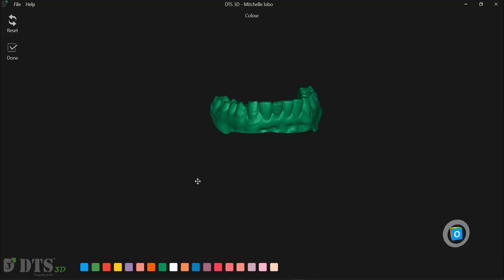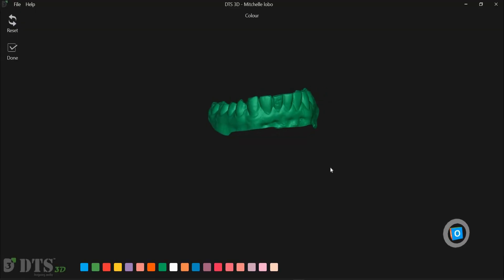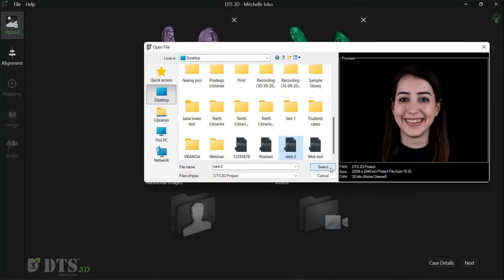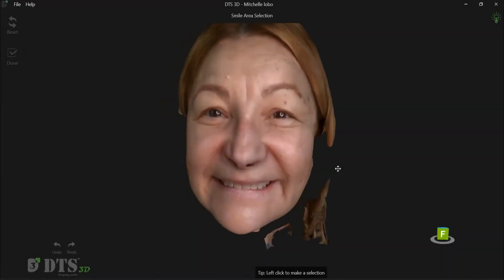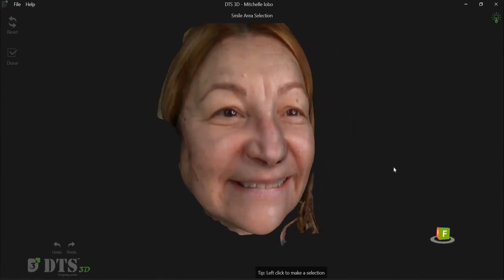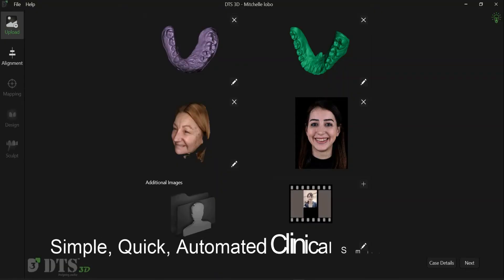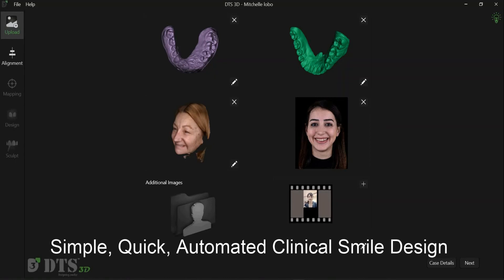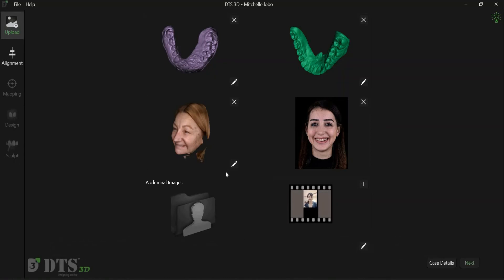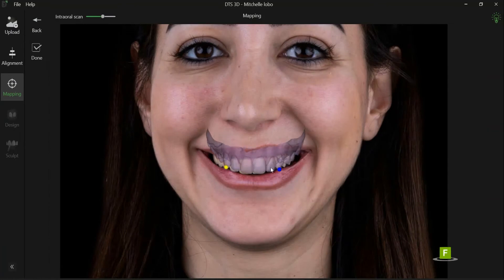DTS3D allows importing and overlaying intraoral scans, patient photos, 3D face scans, and videos. The intuitive user interface is powered by an artificially intelligent system. The intraoral scans can be overlaid with the images and the face scan with just a few clicks.